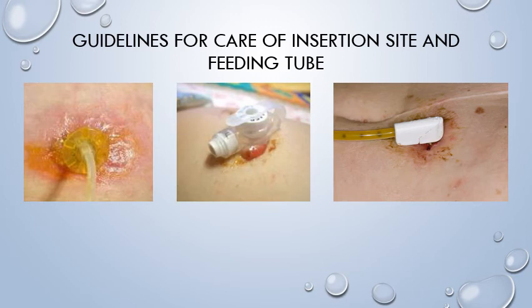Each day, use a gauze or a clean cloth to clean the tube and the skin at the insertion site with soap and water. Using circular motions, move away from the tube to the outer areas. Keep the area clean to avoid skin breakdown at the insertion site.